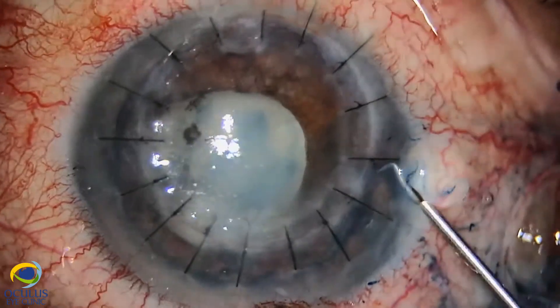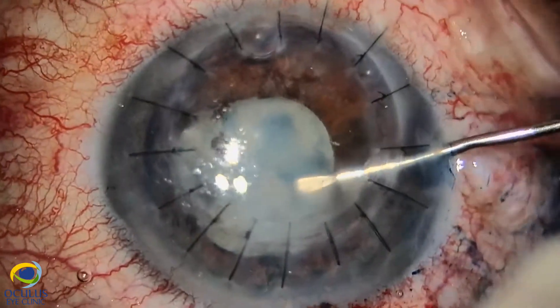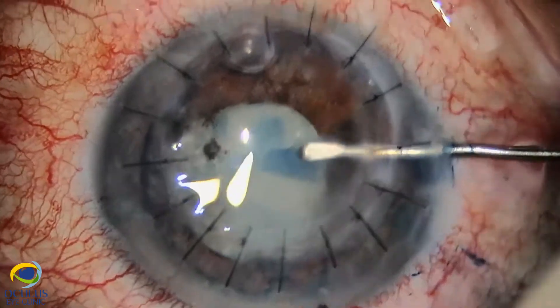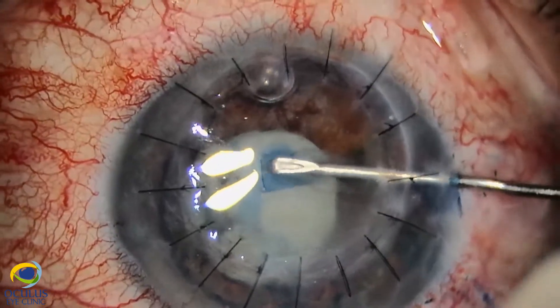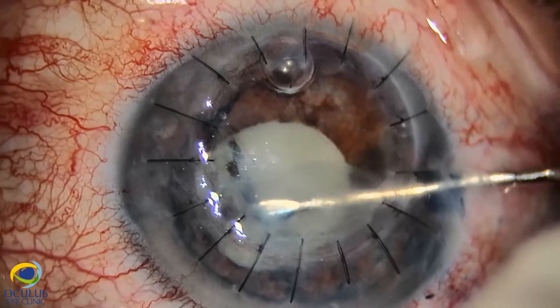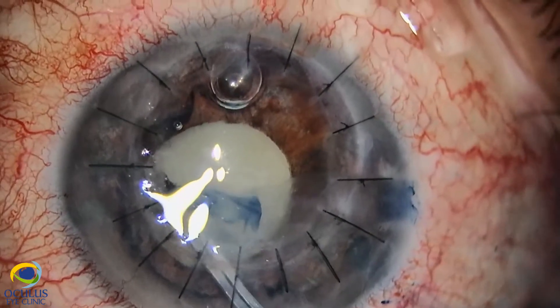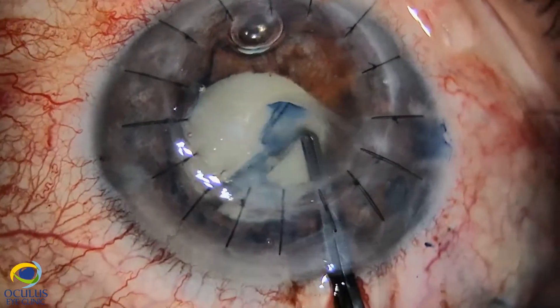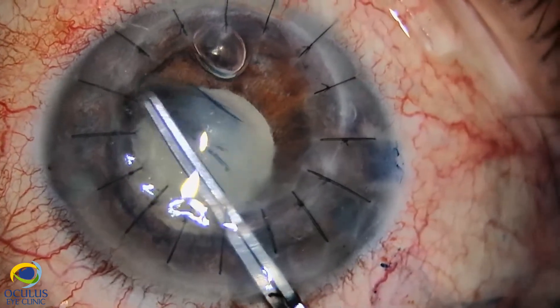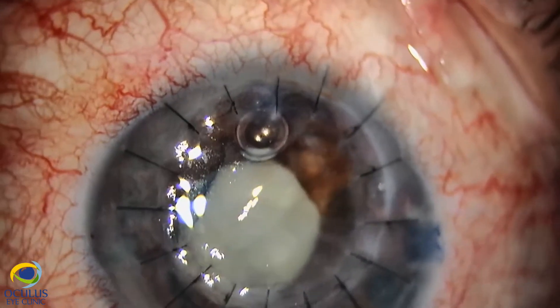We dyed again to better visualize the anterior capsule. Because we are dealing with an intumescent white cataract, we performed the CCC starting with a cystotome via paracentesis under OVD, which preserves a deep anterior chamber. We used Provisc under Viscoat — Provisc also keeps the cortex more or less in the bag. We continued the capsulorhexis with capsulorhexis forceps, paying attention to avoid run-out. The capsule was covered with a lot of iris pigment mobilized onto it.